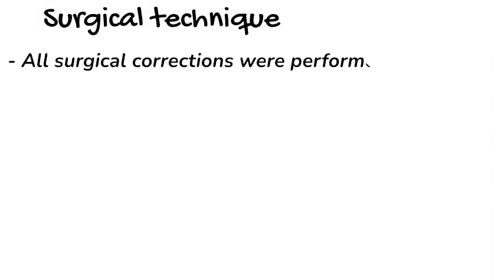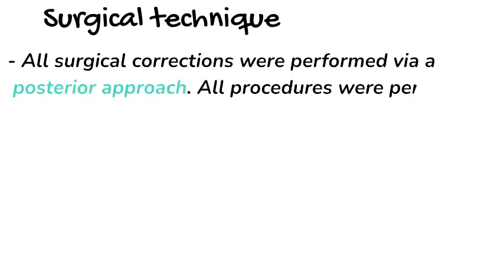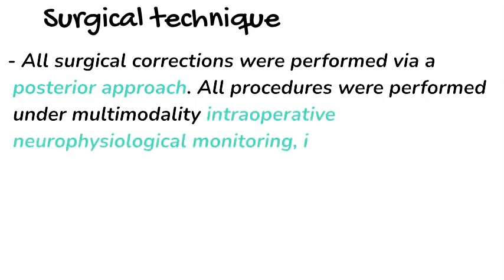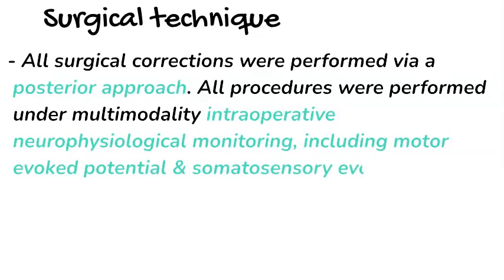Surgical technique. All surgical corrections were performed via a posterior approach. All procedures were performed under multimodality intraoperative neurophysiological monitoring, including motor evoked potential and somatosensory evoked potential.